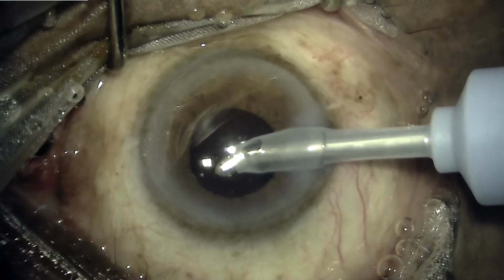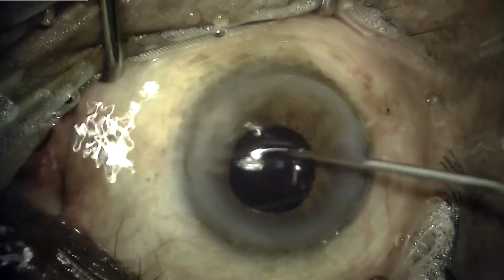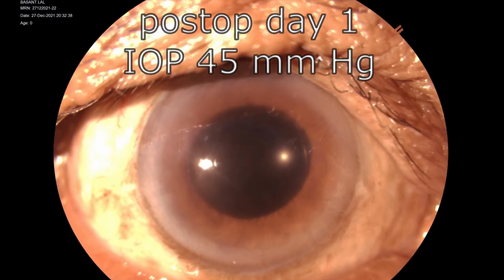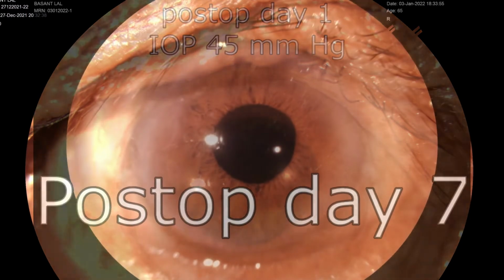Anterior chamber has been washed. It is being inflated. And usually the end result is that some amount of viscoelastic will always go through the PC rent and will be a contributing factor for increasing the intraocular pressure. Here we can see that.